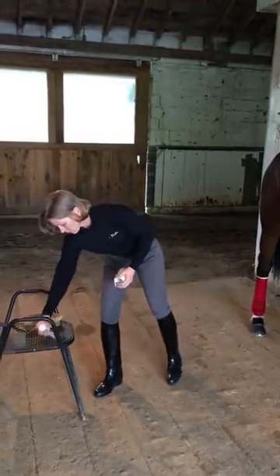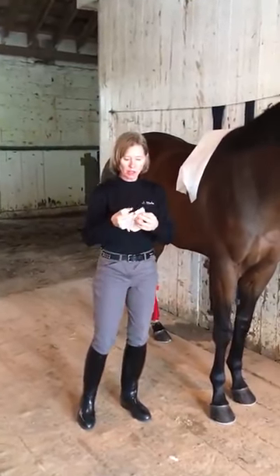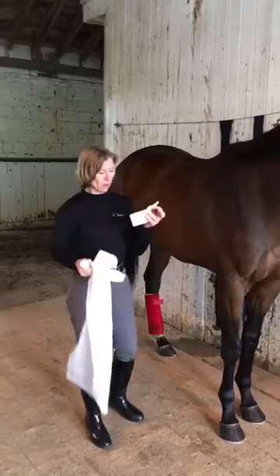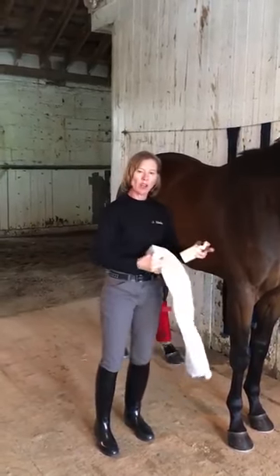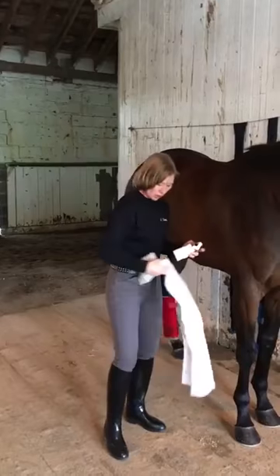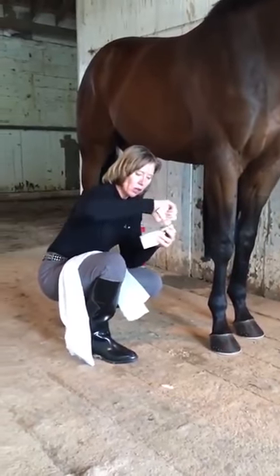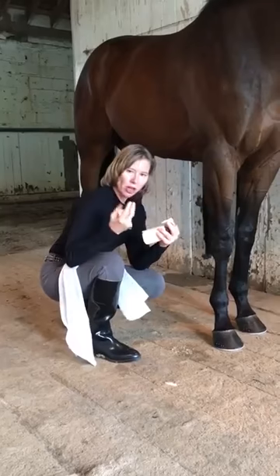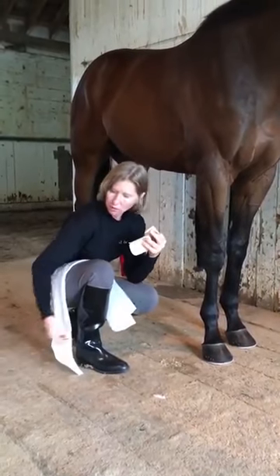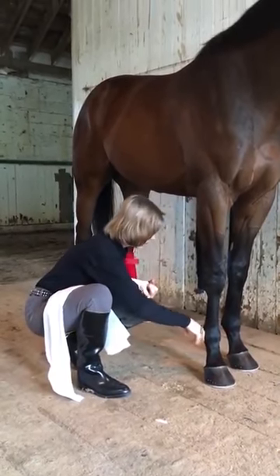So I want to show you how to put this on without injuring the animal. You have a little piece of gauze to put on the wound — this horse doesn't have a wound, but we're going to pretend like he does. You take your ointment and a piece of cotton with your vet wrap. You never want to put a vet wrap directly on the horse's, dog's, or cat's leg. You put a little ointment on the gauze pad — not on your finger first, because you're just introducing more germs. Stick it on wherever the wound is.